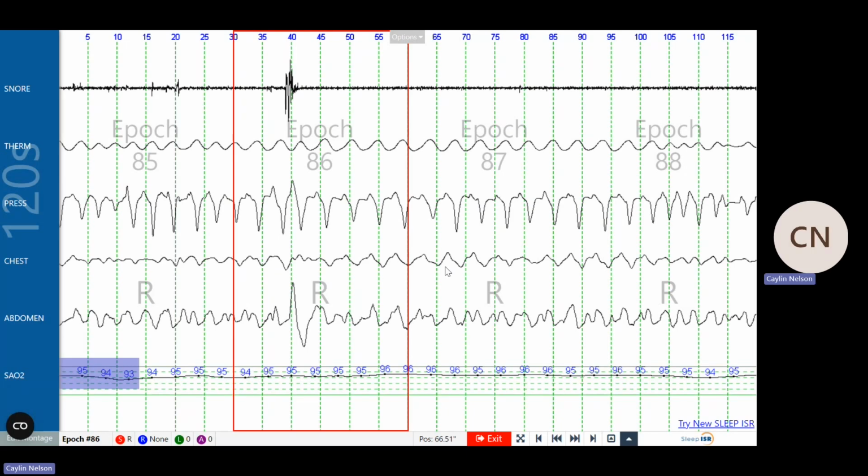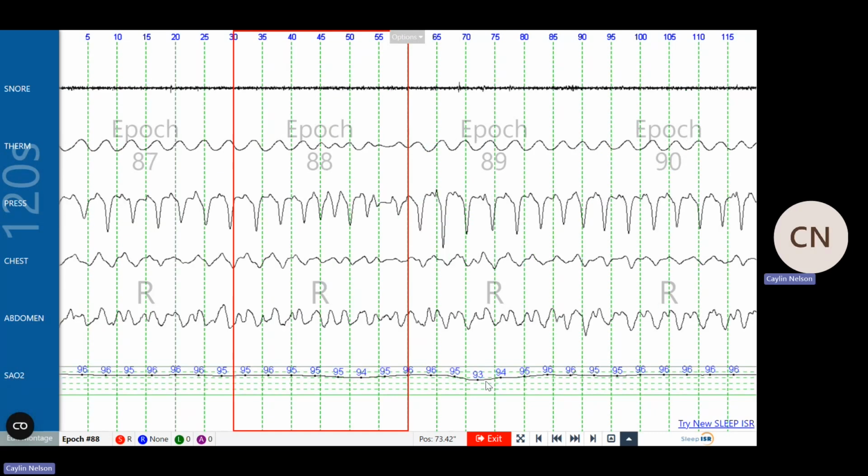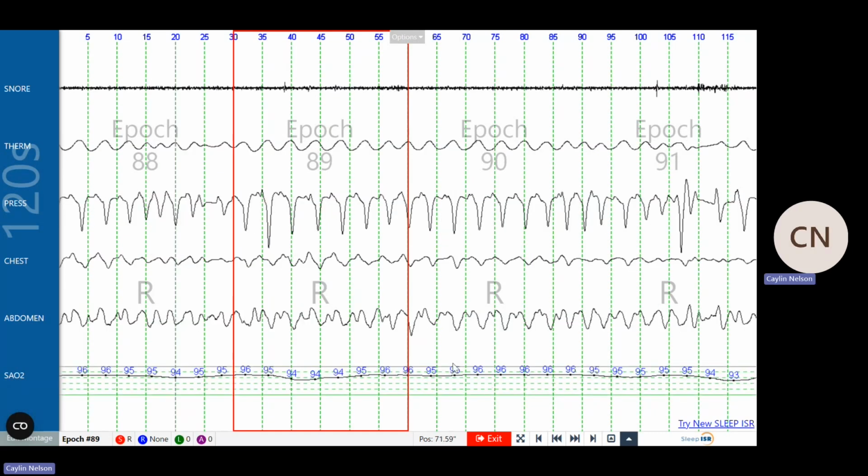So typically with REM, you will likely have less arousals just because your body is so relaxed and it's gone through that paralyzing process. So you'll see less arousals. When you go into scoring arousals, the flows change up a little bit from REM to N1, N2, N3.